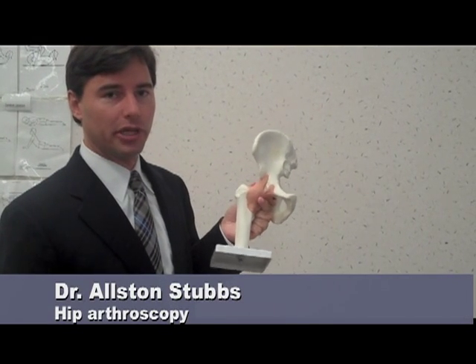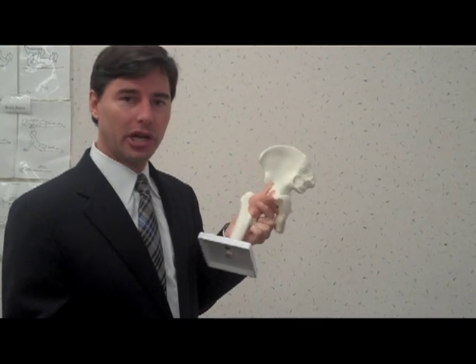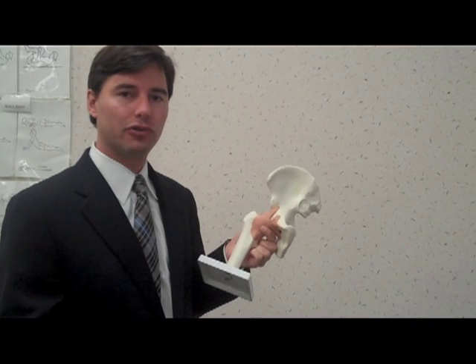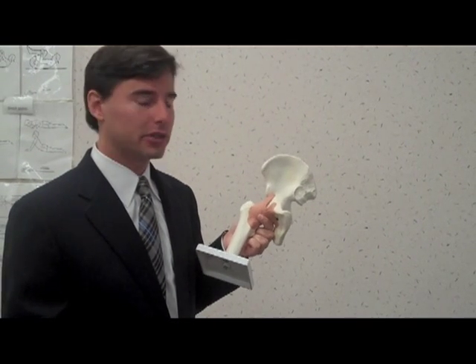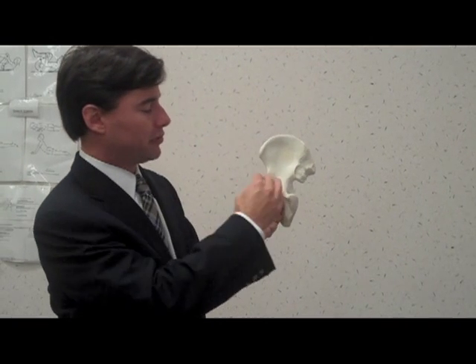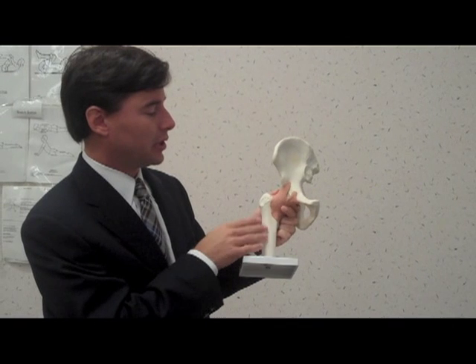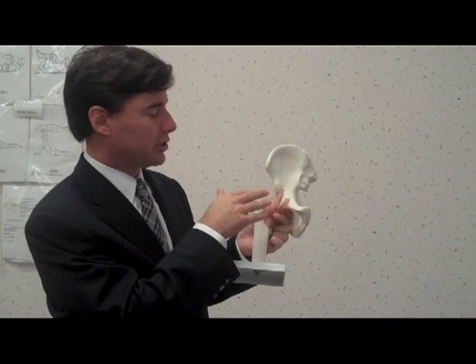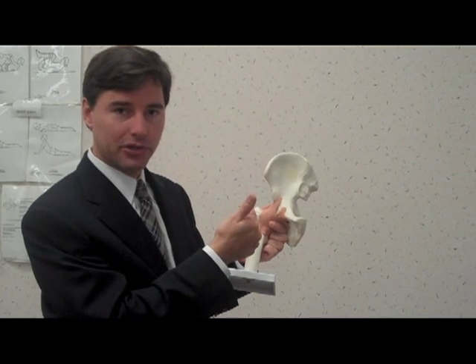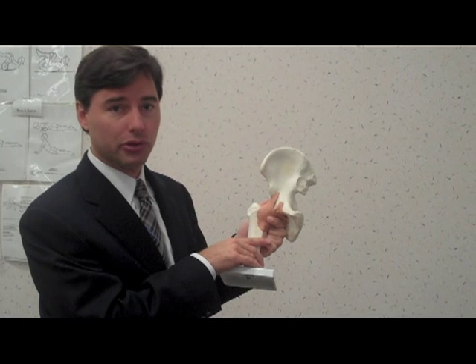The beauty of hip arthroscopy is that we can basically preserve the native hip joint. The ball and socket that you were born with, we can try to preserve and maintain, hopefully for the future, for a pain-free active lifestyle. As you can see, the hip is made out of a socket which is part of the pelvis and the ball which comes off of the thigh bone. The goal of hip arthroscopy is to get in and out of your hip without disrupting any of the muscles, any of the tendons, or any of the native cartilage around the joint itself.